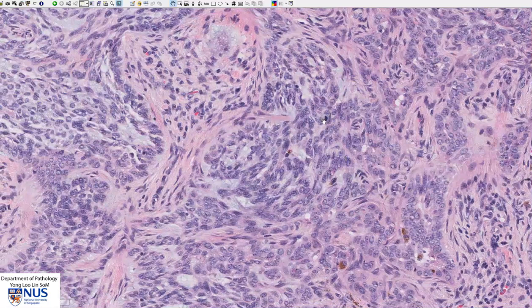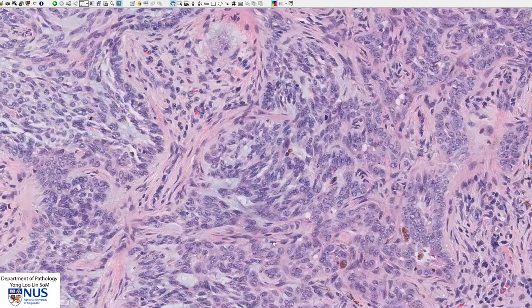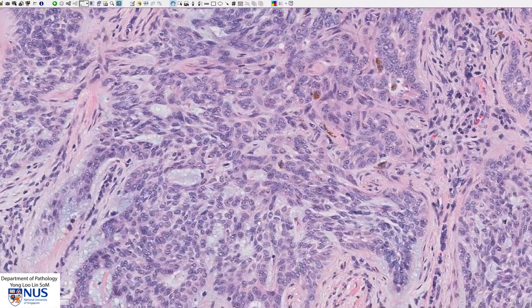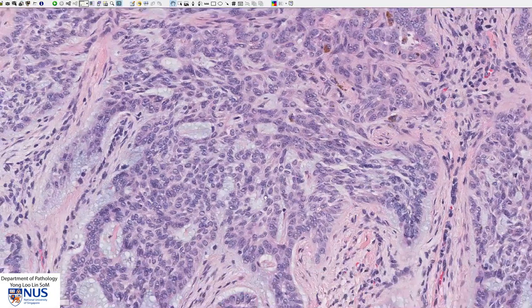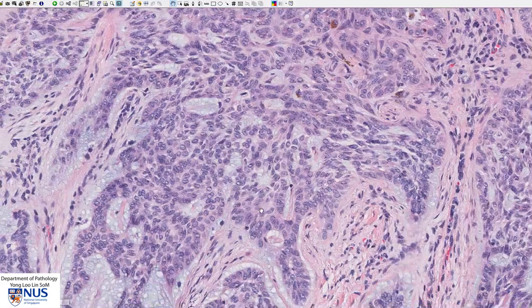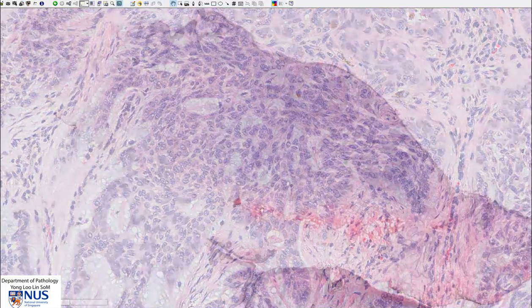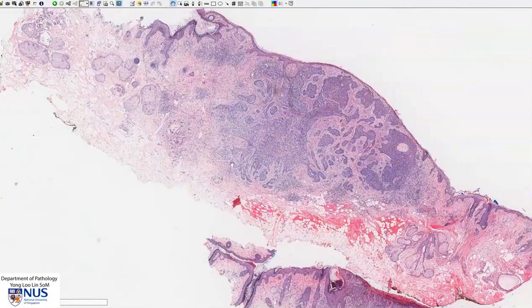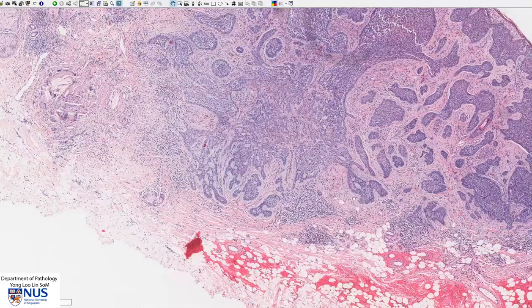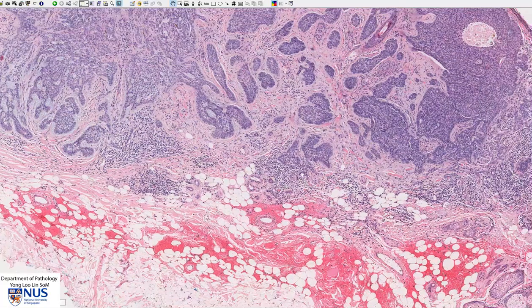We can see a mitotic figure here and another one here. Mitotic figures can be variably abundant in basal cell carcinoma. This tumour appears to infiltrate quite deep into the dermis, just about poking itself into the subcutaneous layer.